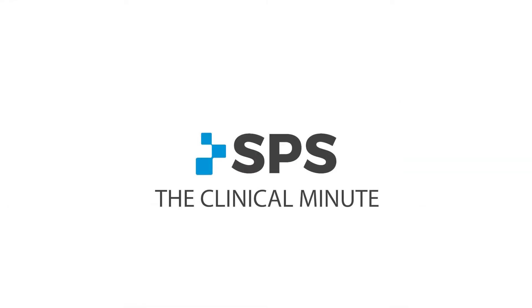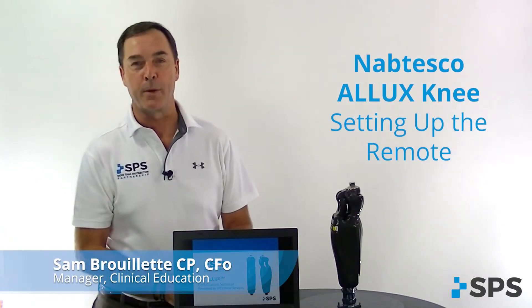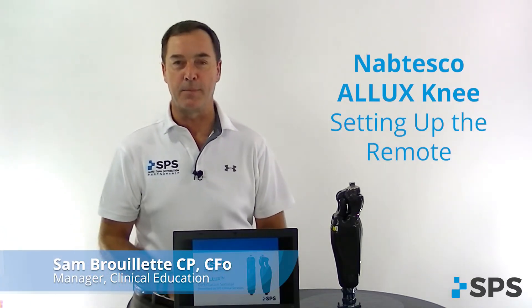Hi, I'm Sam with SPS. Welcome to the Clinical Minute. In this segment we'll go over how to set up and program your remote control for your Alux Neftesco knee.